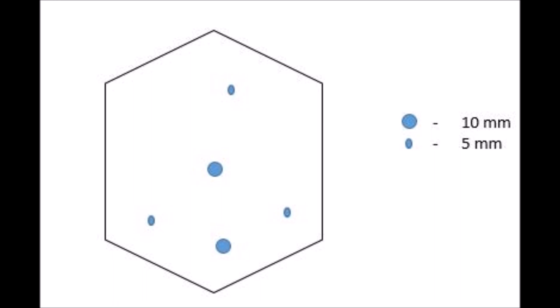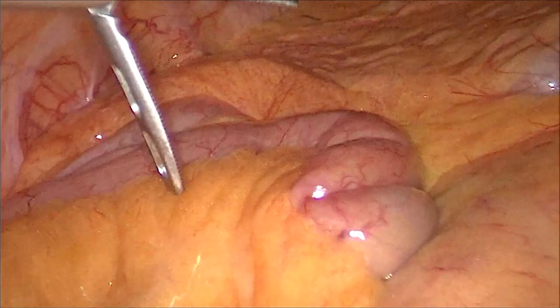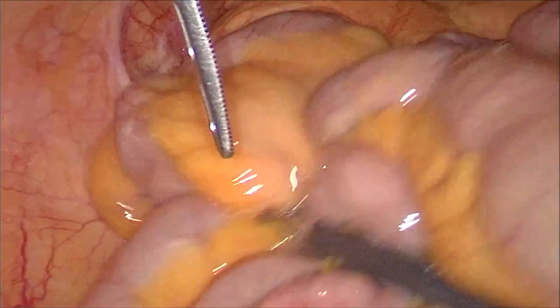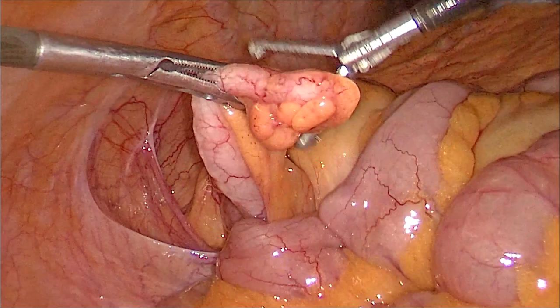The patient was in split leg position. The umbilical and suprapubic ports were 10 mm and the rest were 5 mm. The epigastric and suprapubic ports were slightly towards the left. The surgeon stands in between the legs, and the patient is kept slightly in Trendelenburg and right side up position so as to identify the right colon.